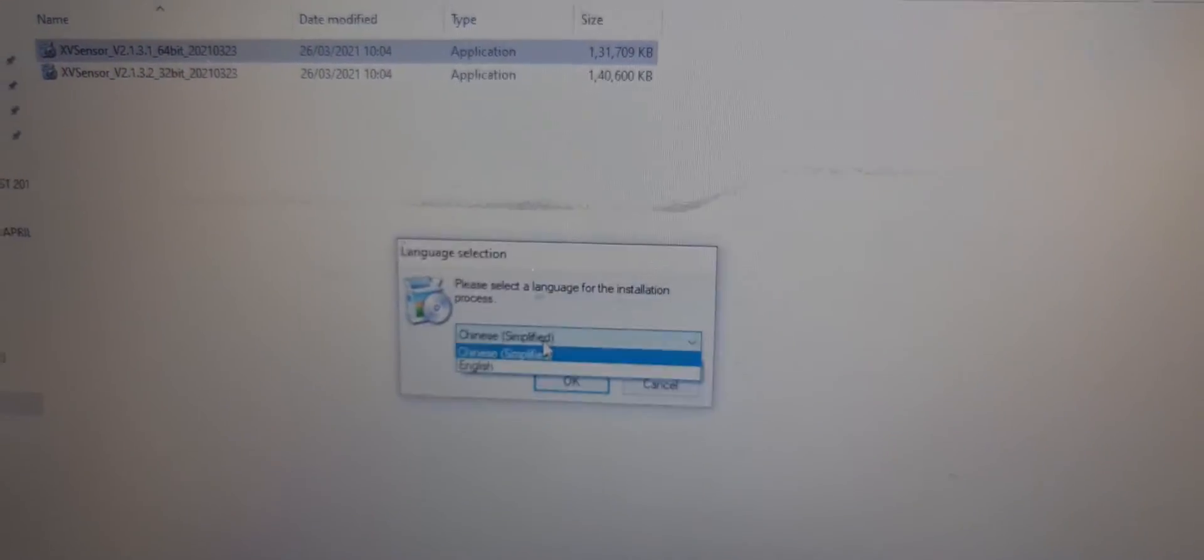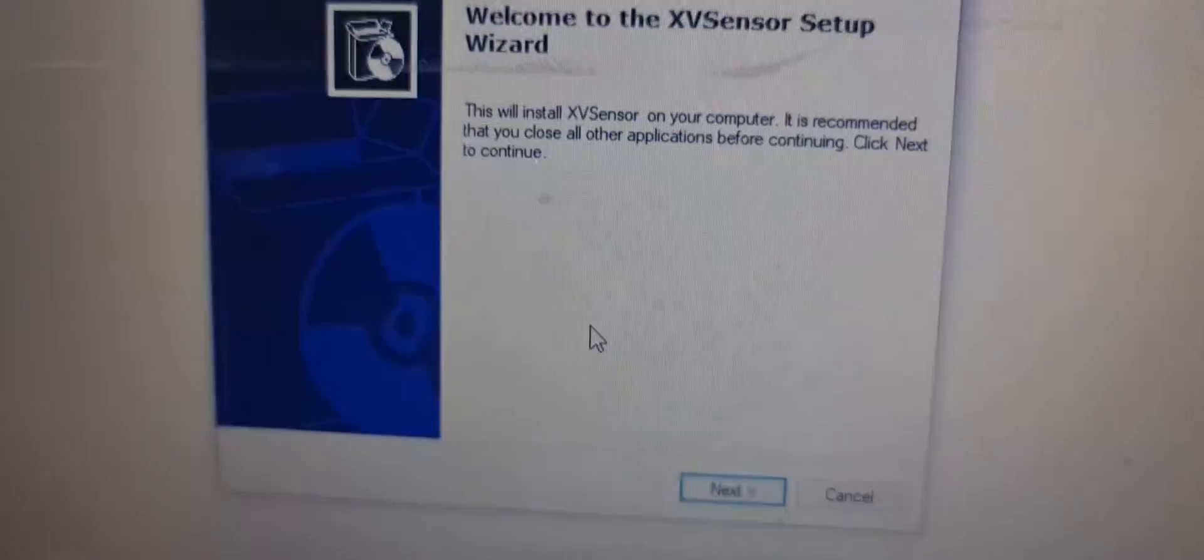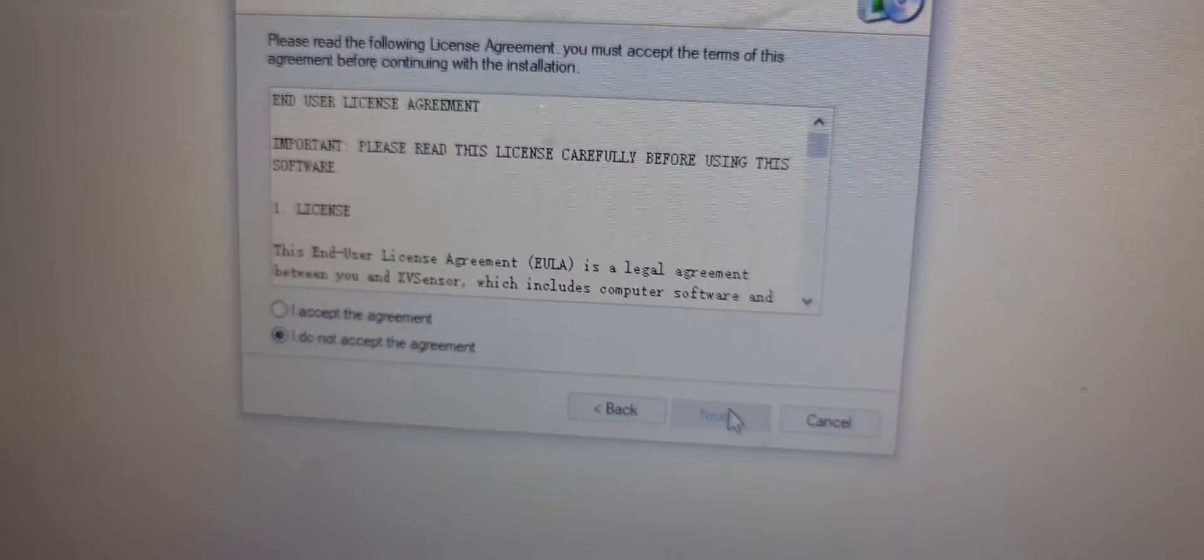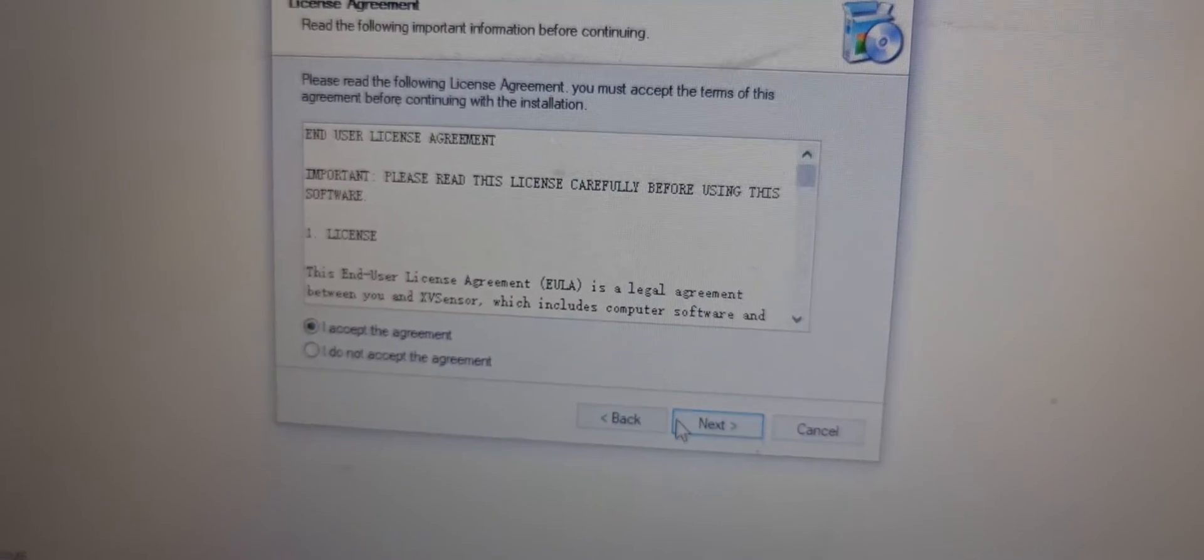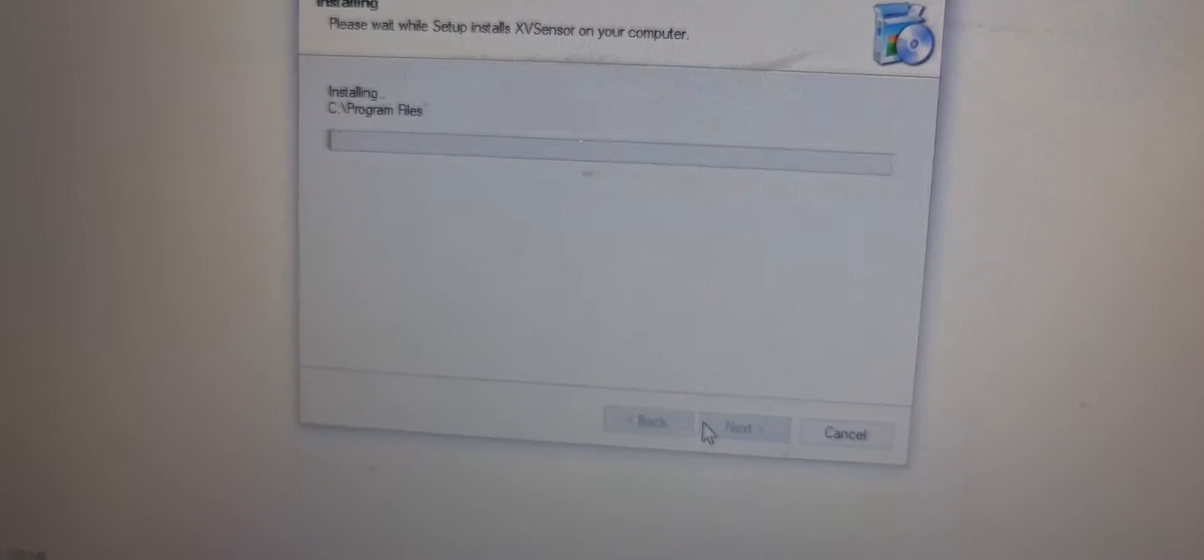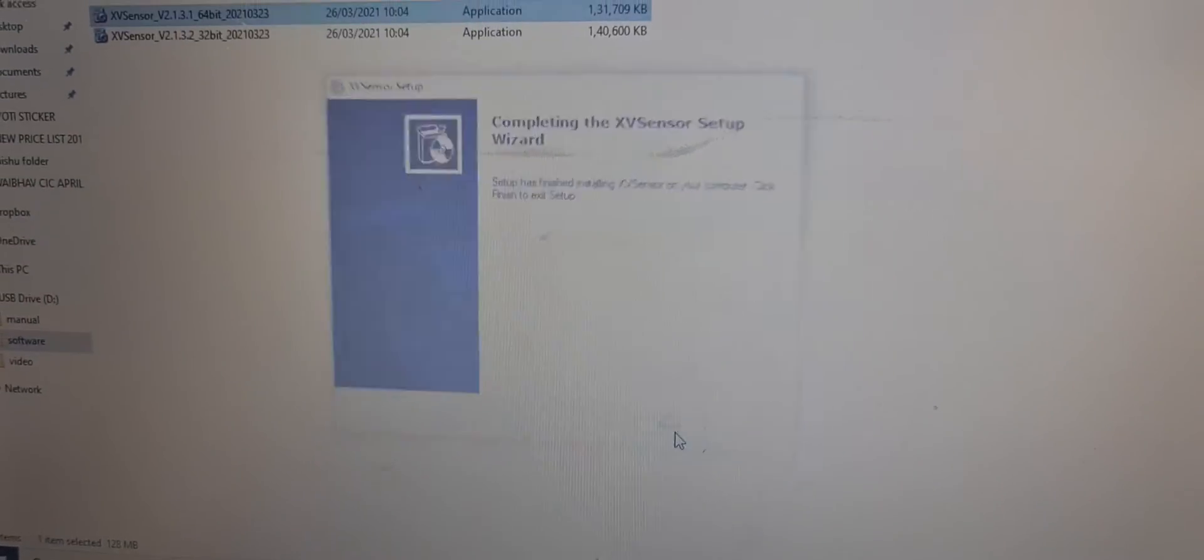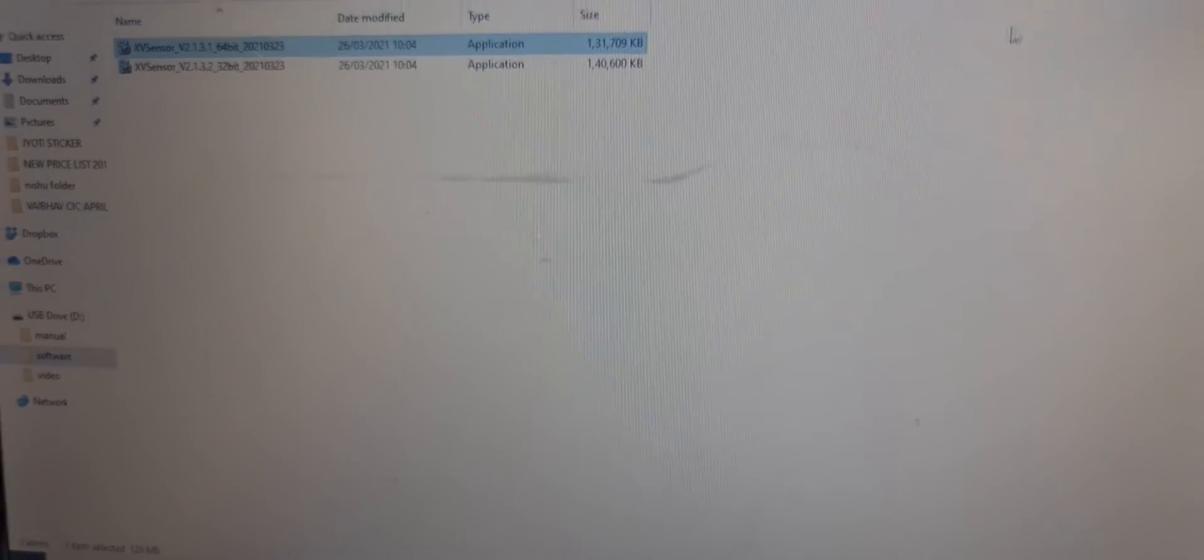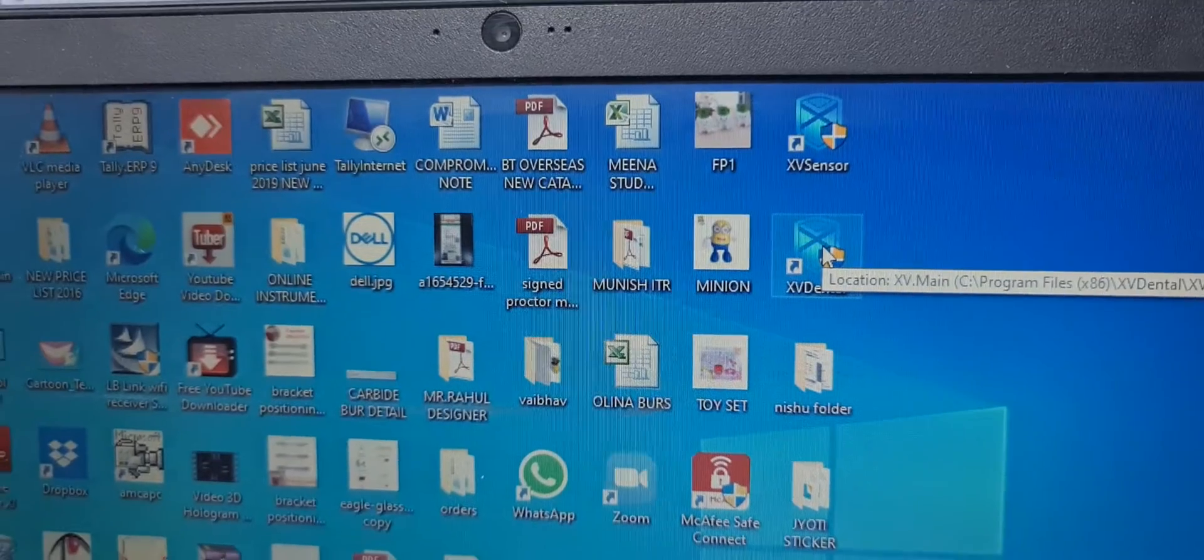So here it is Chinese and English, select the English version, then OK, next, accept the agreement, next, next, next, next, press the finish button. So the software is installed and the desktop icon will be created.